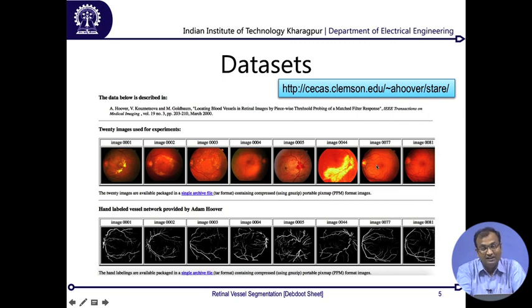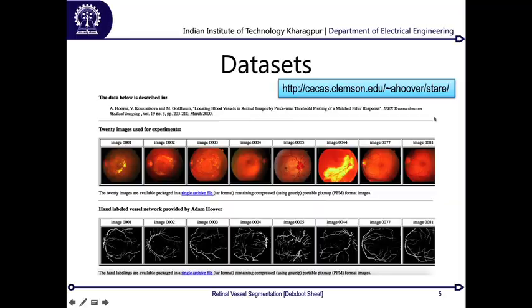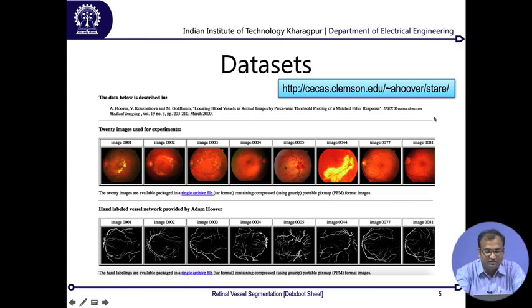So these have both healthy subject data as well as disease subject data. Since we had already discussed systematic evaluation and validation, and I had explained the ratio of subjects from different categories and why you should be preserving the prior probability for each of them, you now have a very clear understanding as to why we need both the symptomatic cases and asymptomatic cases, or disease cases and healthy cases, within our data set, in order to evaluate the performance of our algorithm. So this is one I would definitely put down as a pointer.